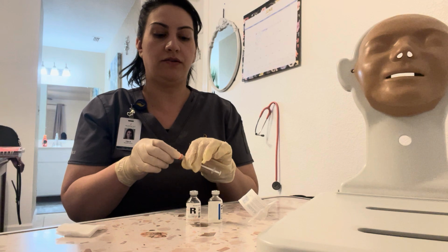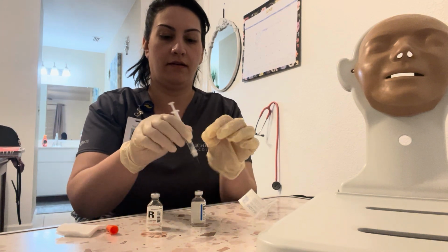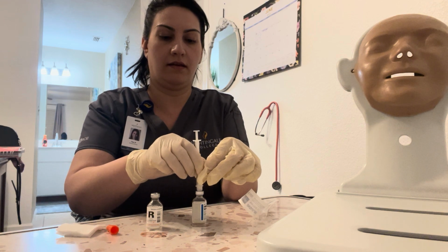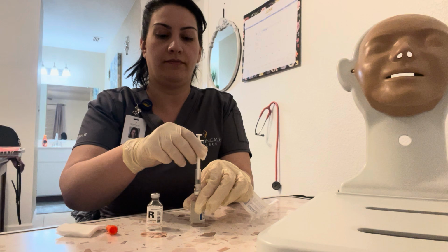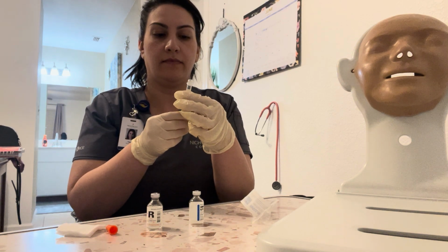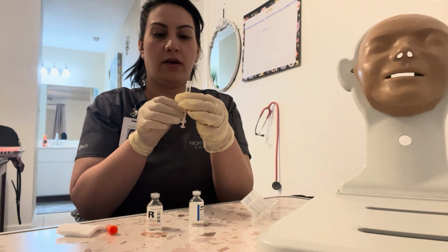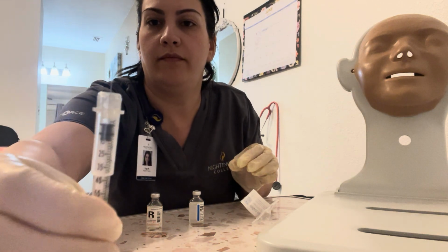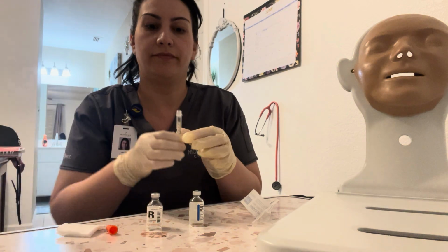Next, I'm going to inject that NPH air, not drawing up any solution. After that, we're going to get the 4 units of air for the regular. Nurse and I verify against the MAR, 4 units of air.